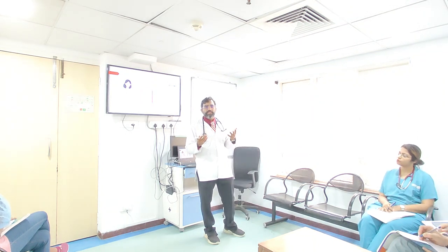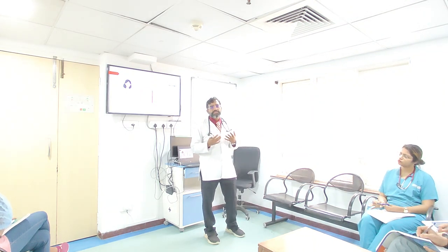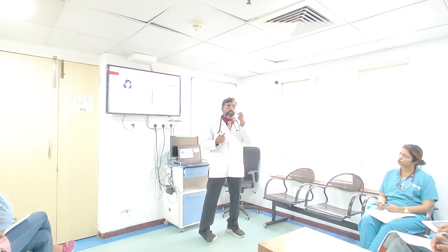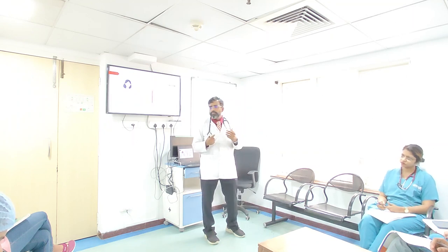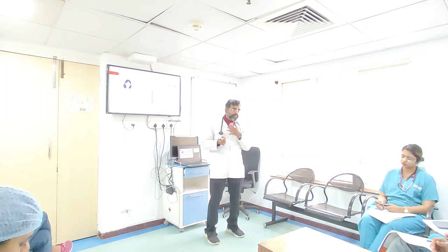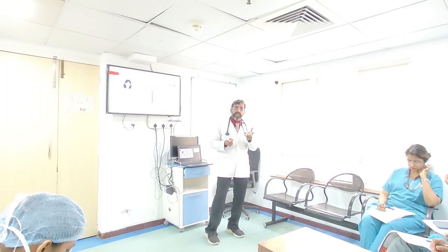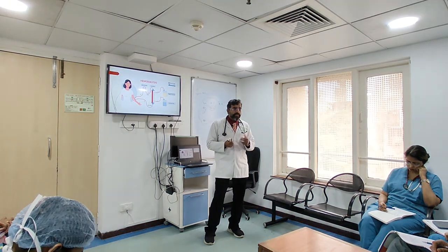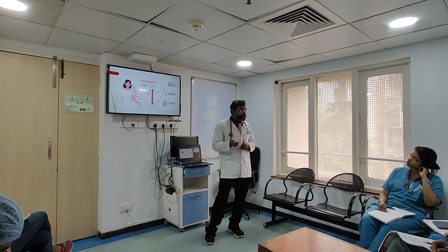Normally, these intermittent hemodialysis therapies are given for patients who are completely hemodynamically stable. If you use this in patients who are hemodynamically unstable, then the speed of the roller pump makes a big difference. If you go up to very high rates, classically 300-400 ml/min, there is a possibility of hemodynamic instability because you're removing blood faster. Since you're removing blood out at a higher rate, there is bound to be a drop in the blood pressure.